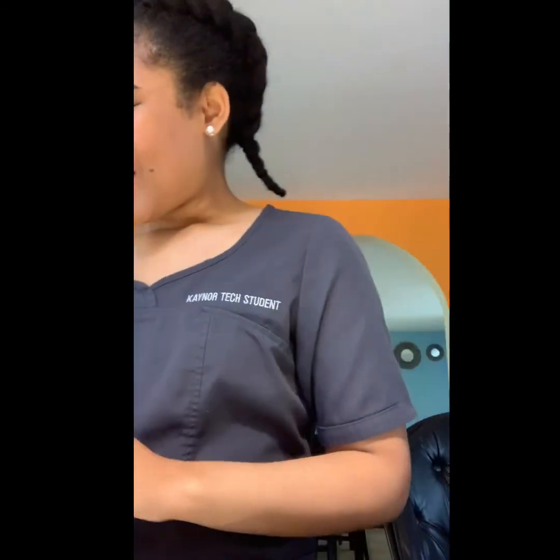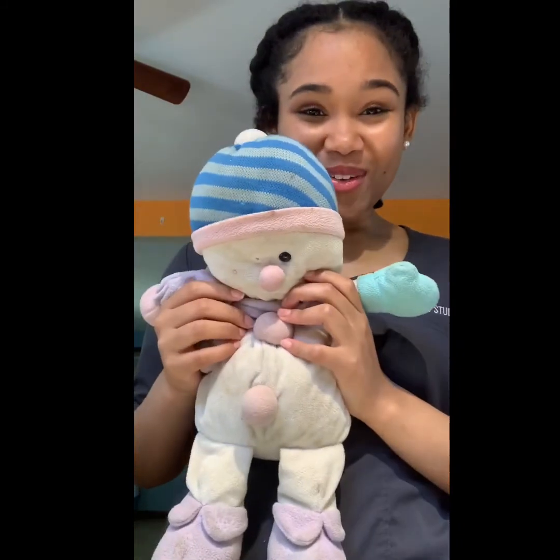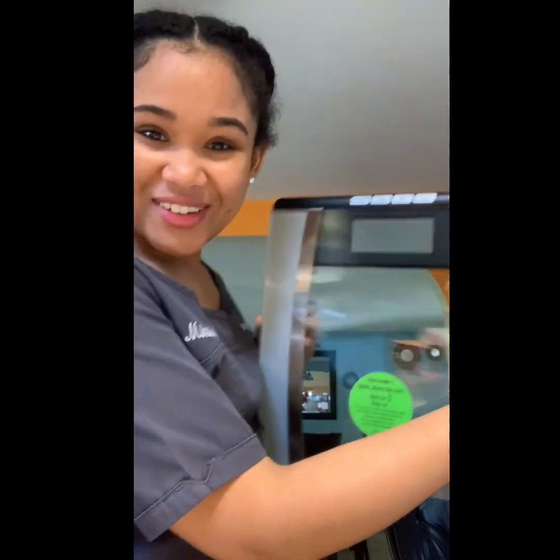So, as stated early on in my slides, the purpose of a newborn assessment is to detect abnormalities or illnesses as soon as possible to give children the help they need as early as possible. Here's my makeshift baby. His name is Snowy. And this is my makeshift baby scale.